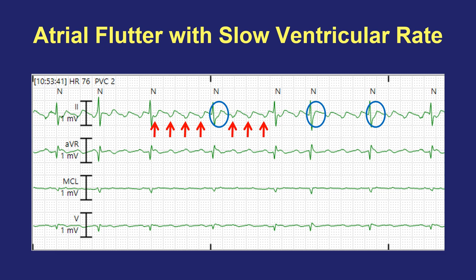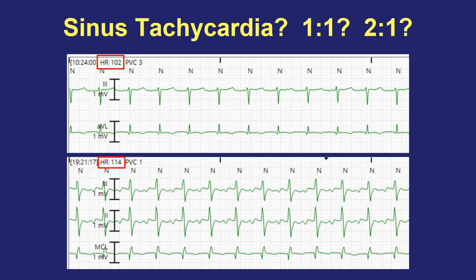Let's review some examples of how to not miss that diagnosis. Here are two examples of patients who were called to have sinus tachycardia — one with a heart rate of 102 and one with a heart rate of 114. In each case, the P waves were either not very visible, or in the bottom example it looked like there was one P wave for every QRS complex, and the patient was misdiagnosed as having sinus tachycardia.